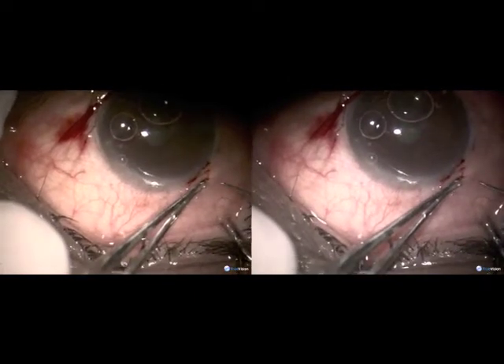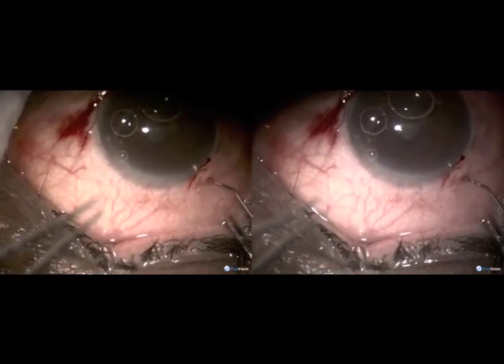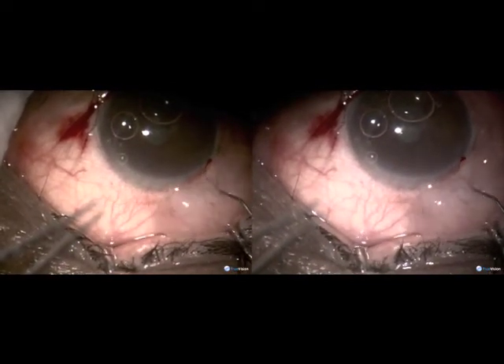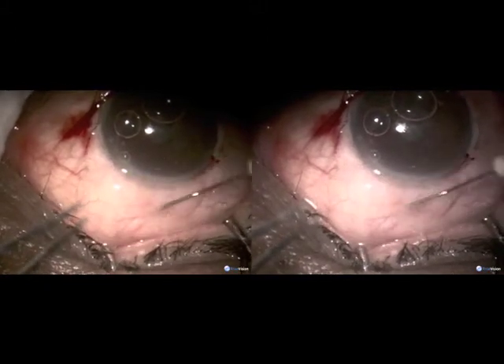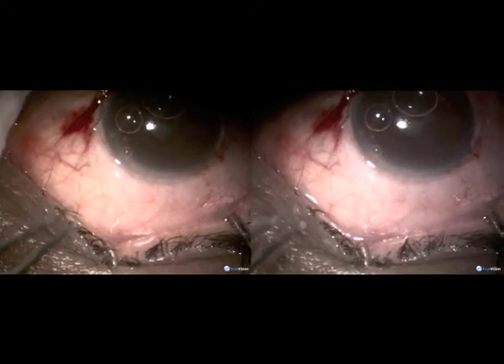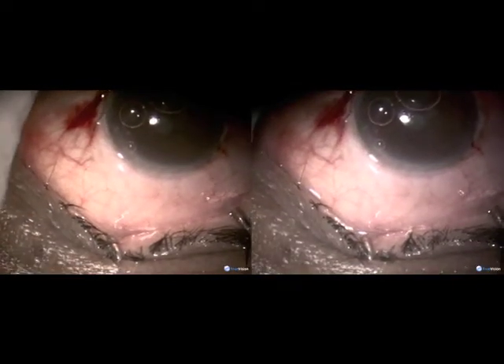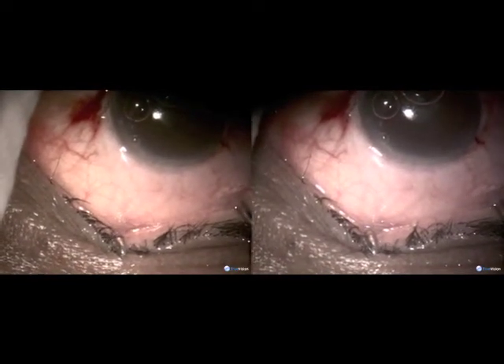An opening is made in the conjunctiva close to the limbus, and through this, mitomycin 0.02% is injected and left there — not washed at all. There is no need.